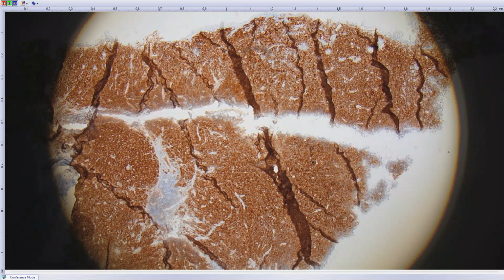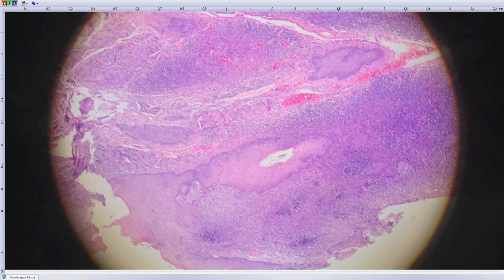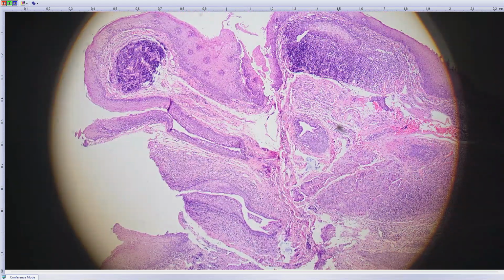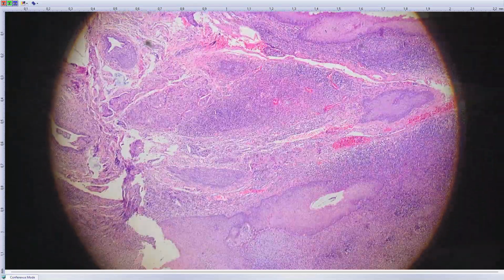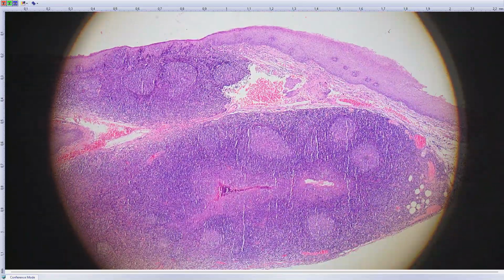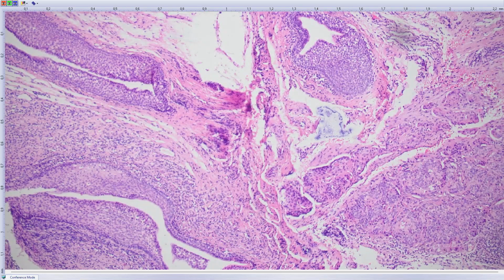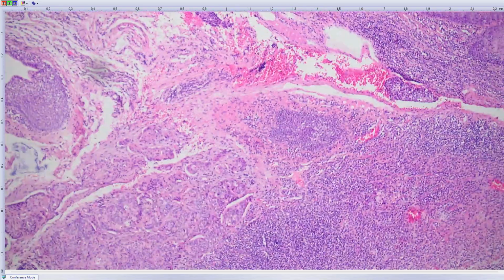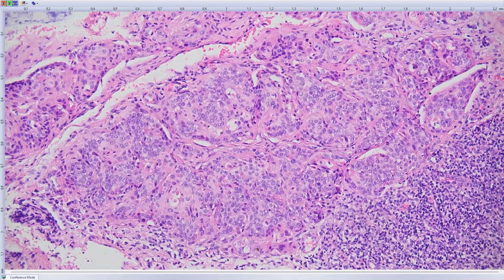So, HPV-associated carcinoma. And the same day, probably the next biopsy I had, was again a biopsy from a tonsil with the suspicion of tumor, and I almost missed the case because from very low magnification you cannot really see it, but it's there. It's less than 1 millimeter.